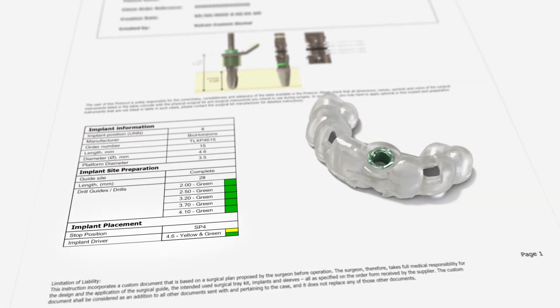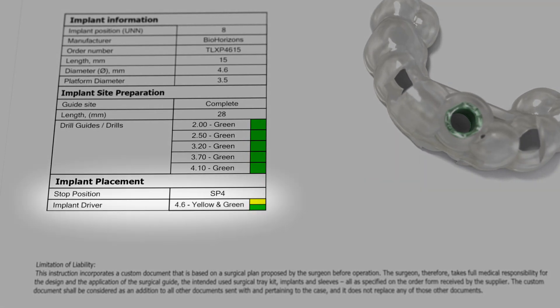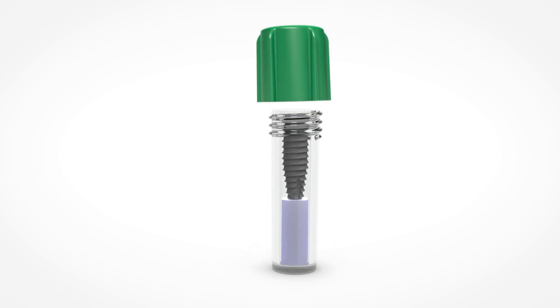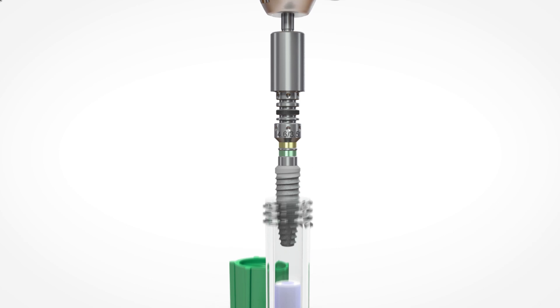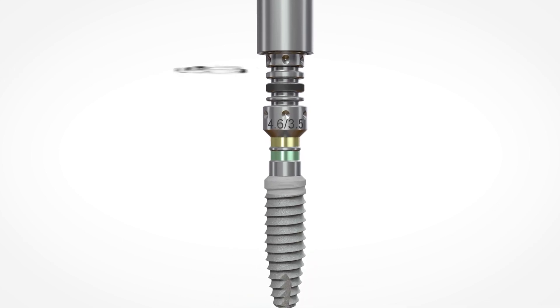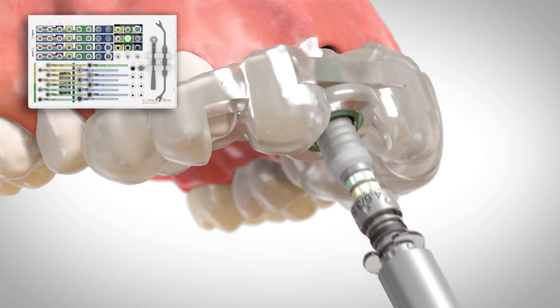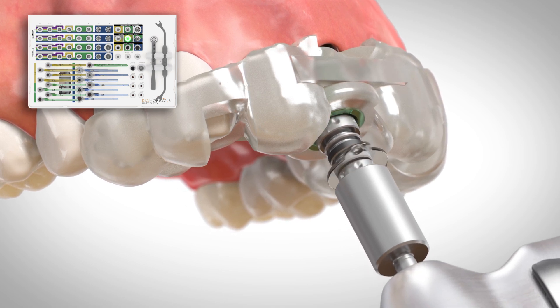Verify the driver and stop position recommended on the surgical protocol. Pick up the implant using the driver and place either a disposable depth stop or depth stop handle in the correct stop position. Place the implant through the guide until the depth stop rests on the top of the master cylinder.